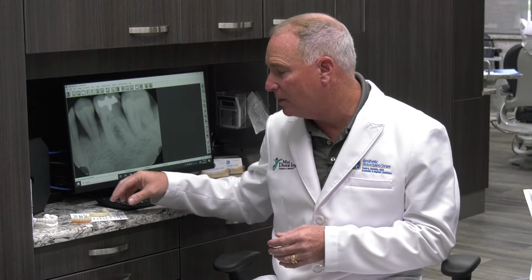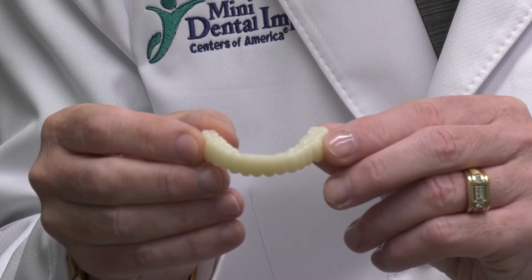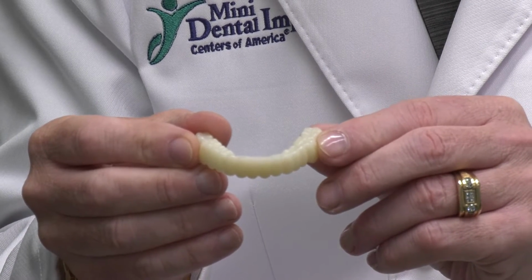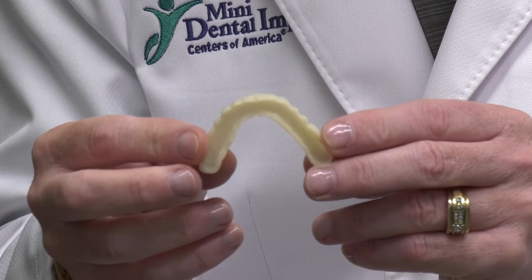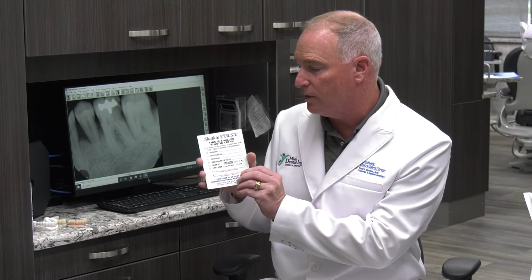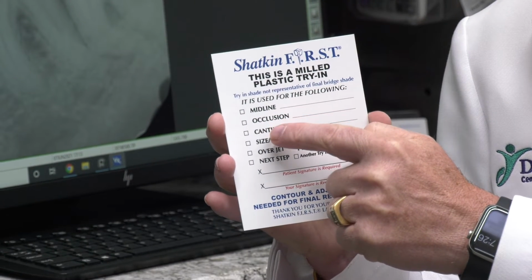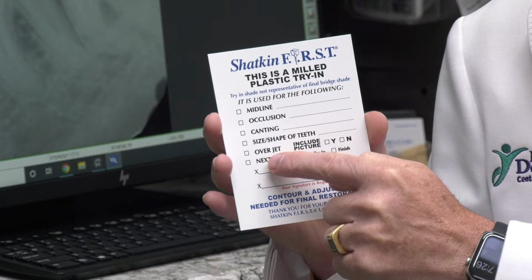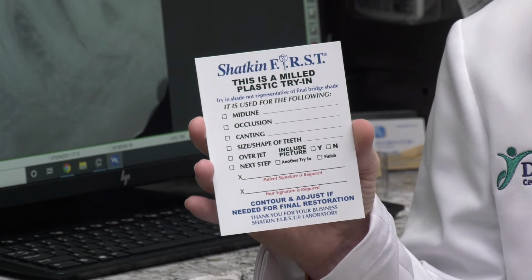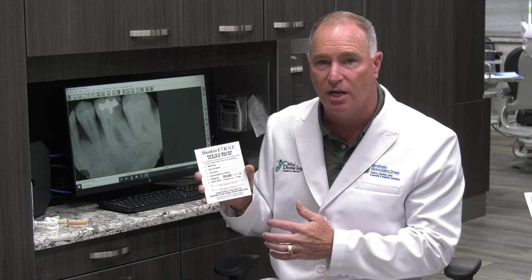The next thing we want to do is a try-in, and this is very important. You want to do a milled try-in that's troughed out so that it fits over the implants, and you can check the vertical, the aesthetics, the bite, all of that stuff on a try-in. Those things can all be adjusted, and you get this little card with the try-in, and this is a milled plastic try-in. You're going to check the midline, the occlusion, canting, size and shape of teeth, overjet, and the next steps, okay? So make sure you mark those off, and if you're making some changes, make a note of what you changed, and all you need to do is go ahead and do the changes on that try-in.